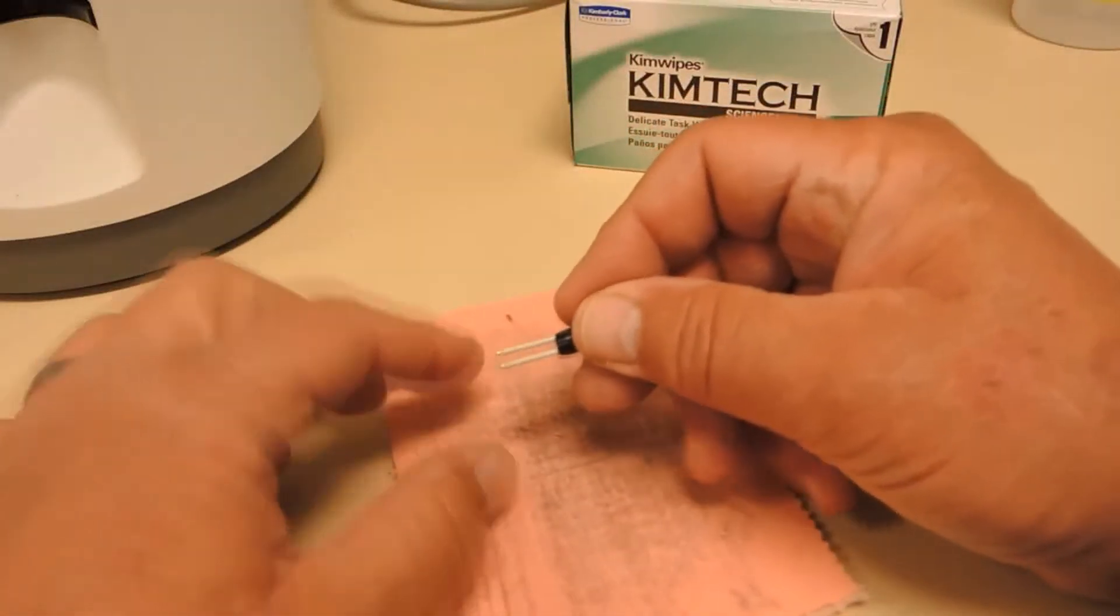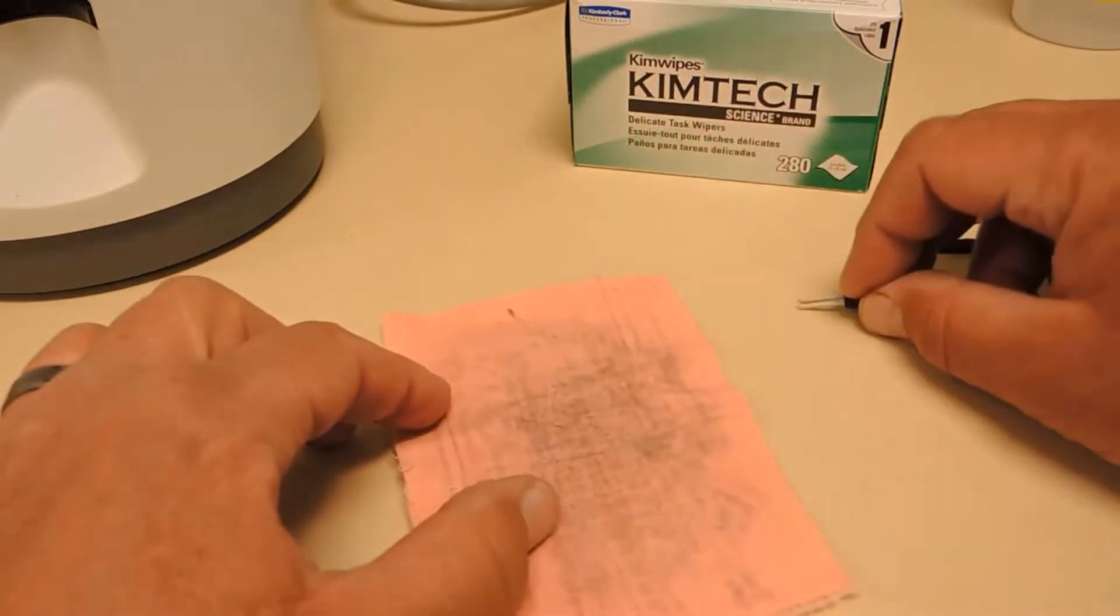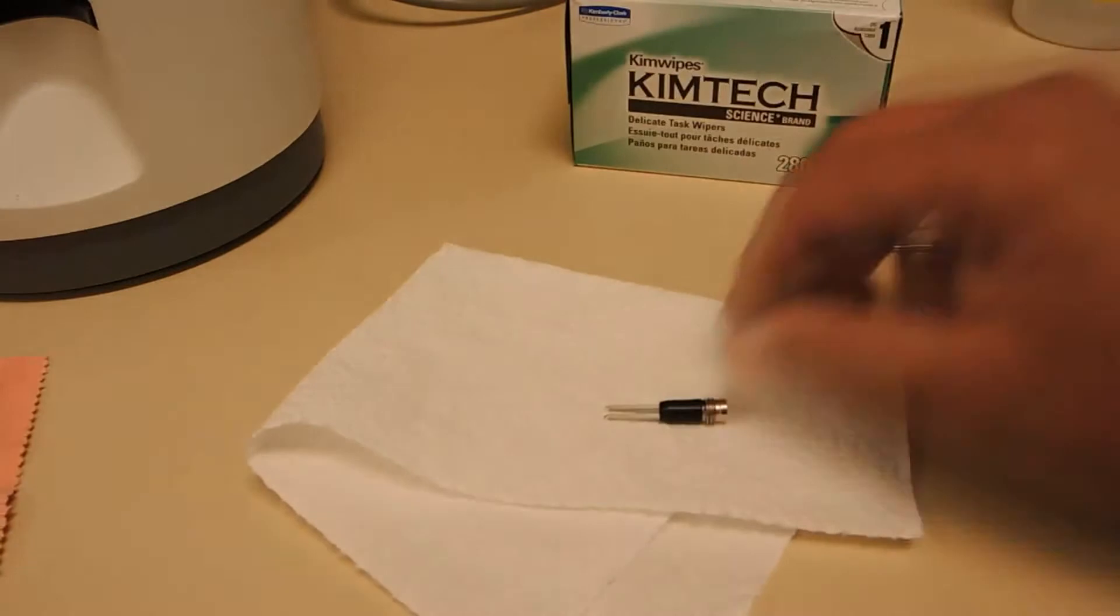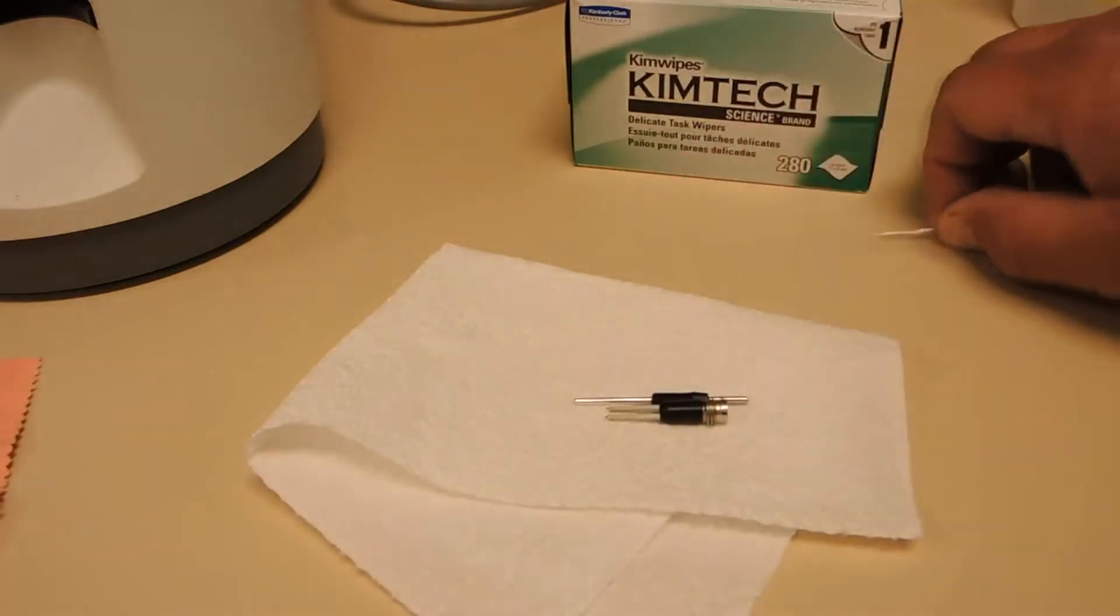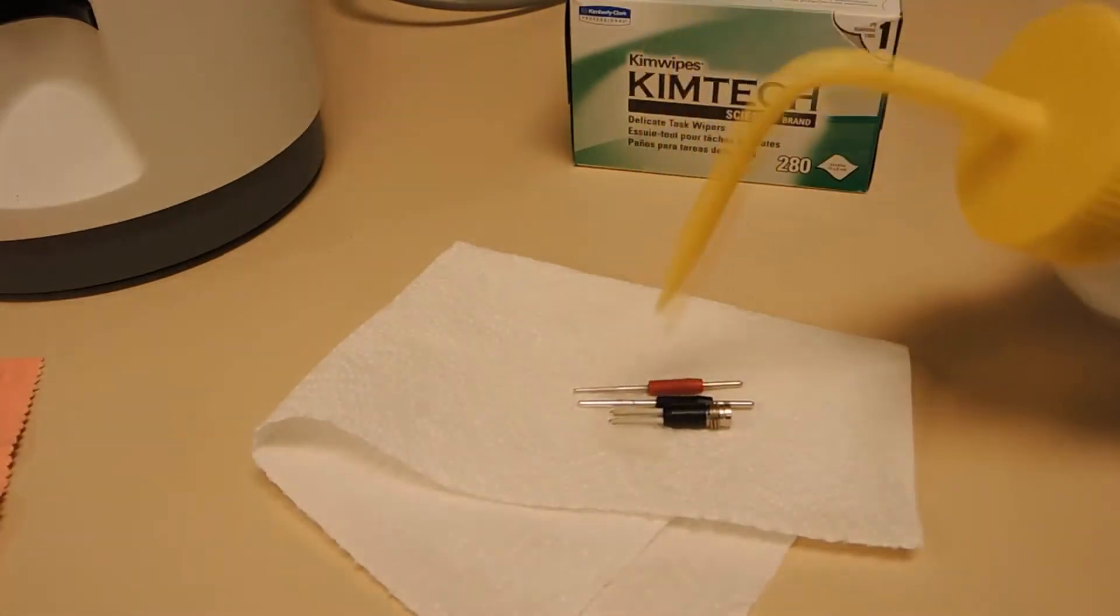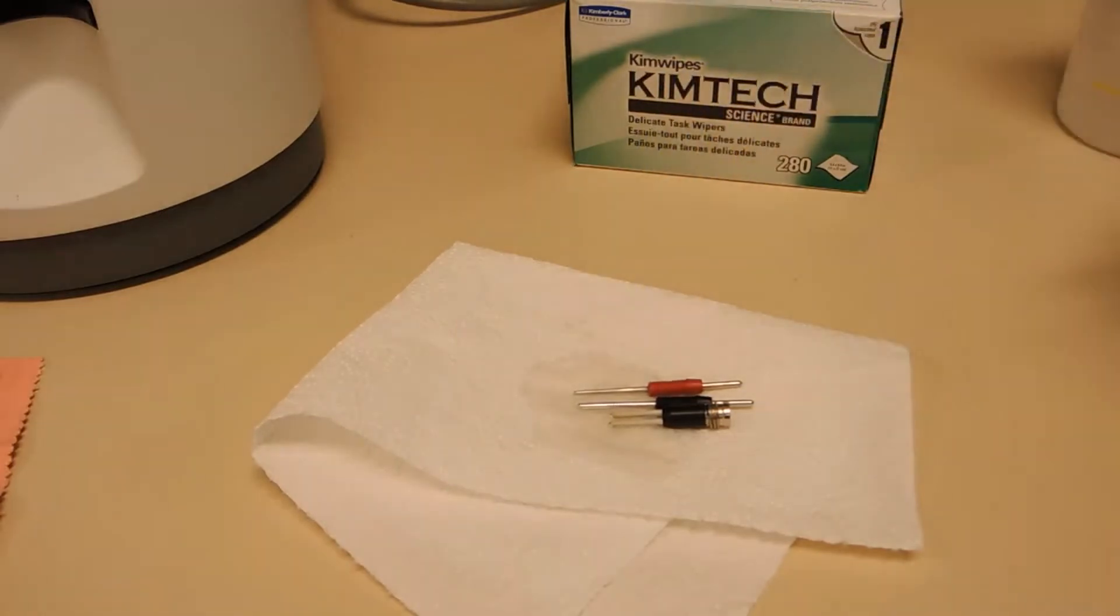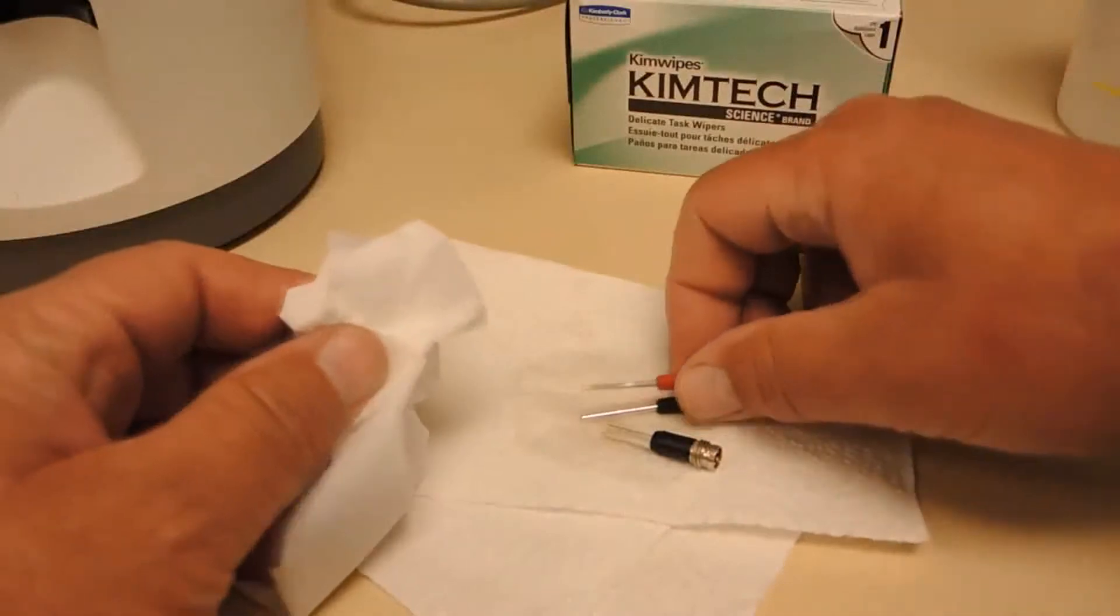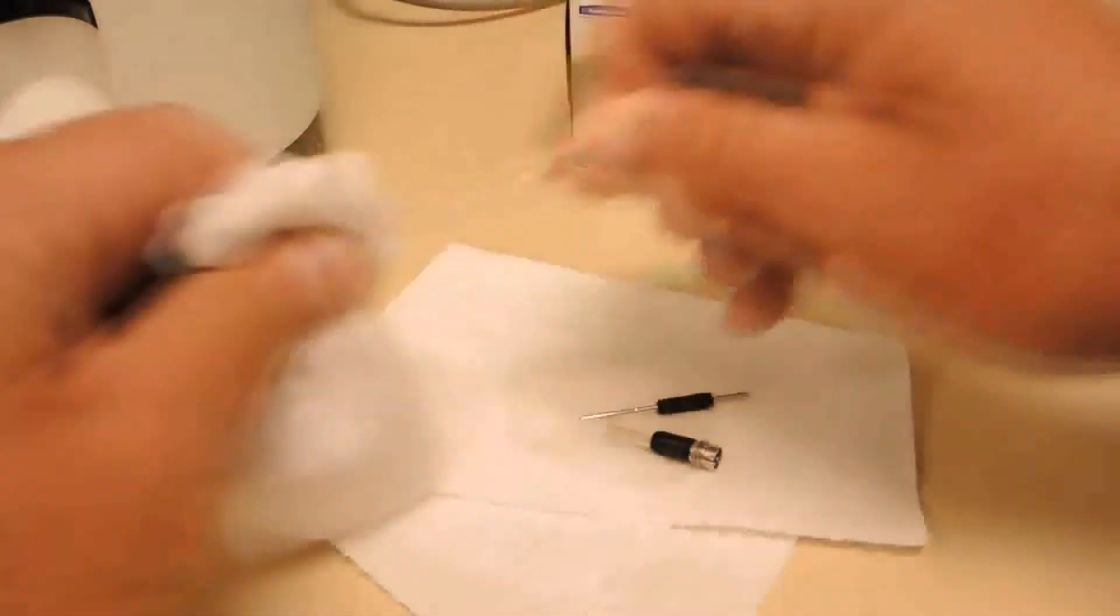And after you've got that done you make sure the electrodes are straight, and then the next thing you'll do is rinse them off with DI water to remove any of the silver cleaning compound that may be on them. Rinse them off with DI water and then dry them with the chem wipe.